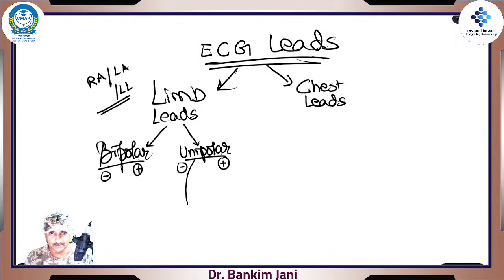Because once you understand this, it becomes very easy. Our intention today is that by the end of this session, the moment it is said that it is lead one, you immediately say, yes, I'm watching the heart from the left side. If that is clear, our purpose is served. From tomorrow, everything will be crystal clear. Then it will be like simple mathematics. Tomorrow mathematics will come.